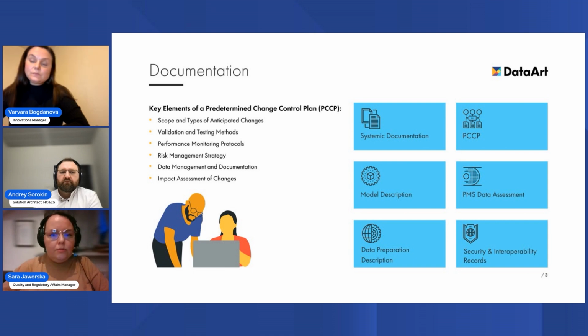Another requirement related to product documentation, by the way, which is only specific right now to the FDA, is the predetermined change control plan. It documents the frames in which the model can operate and can change. It includes an impact assessment, an outline of related risks, and how changes will be validated.